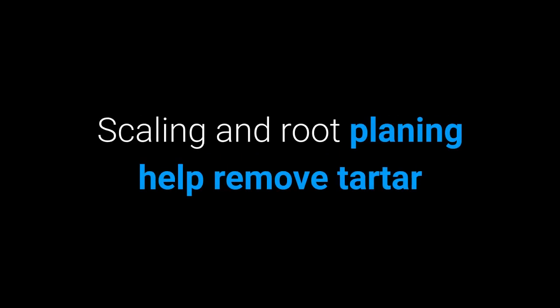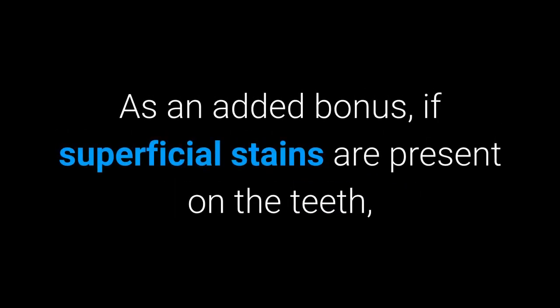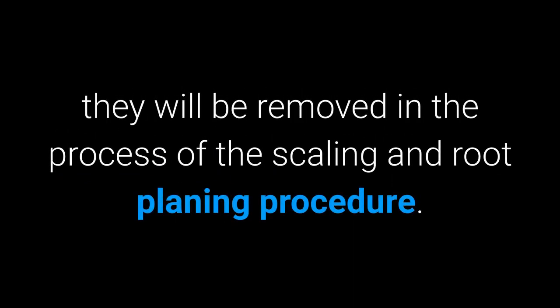Aesthetic effects. Scaling and root planing help remove tartar and plaque from the teeth and below the gum line. As an added bonus, if superficial stains are present on the teeth, they will be removed in the process of the scaling and root planing procedure.